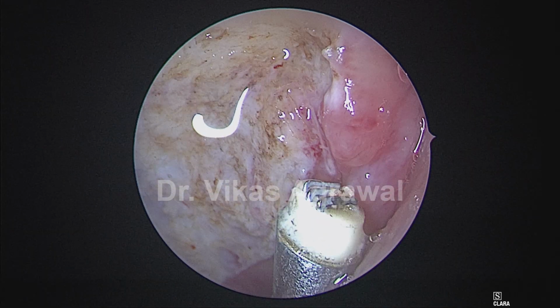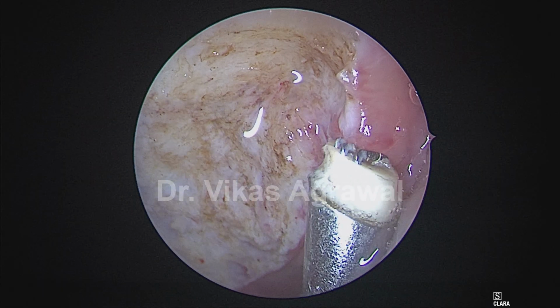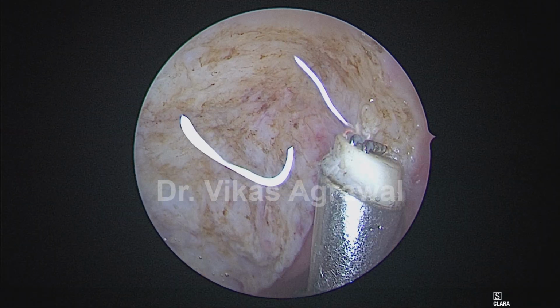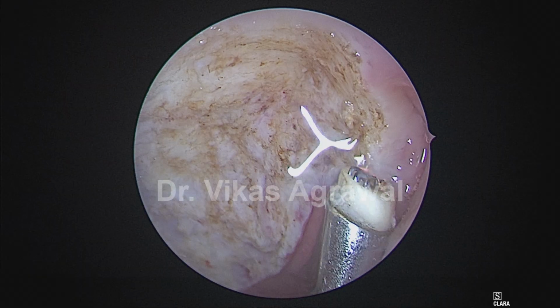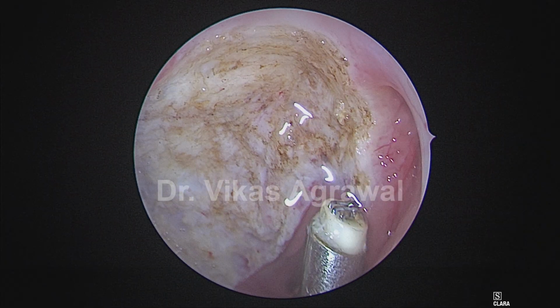So now this is the torus tuberous, and you can see the lymphoid tissue on the torus tuberous. So this is the lateral boundary anteriorly. This is the eustachian tube orifice.